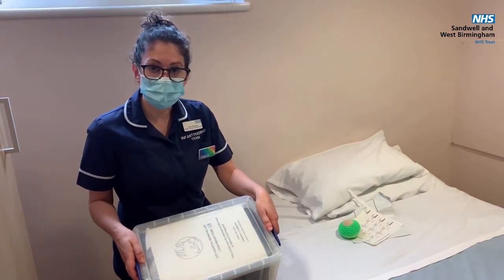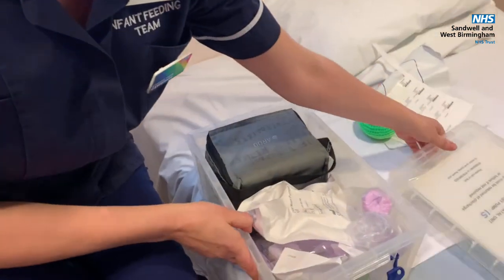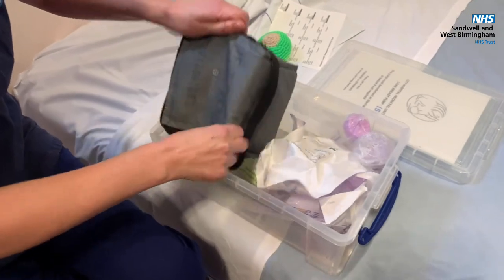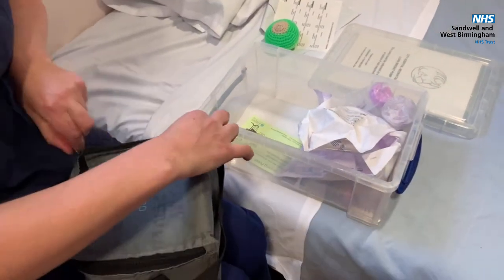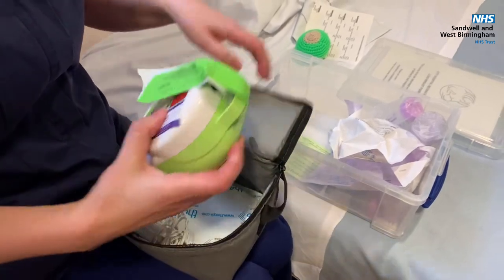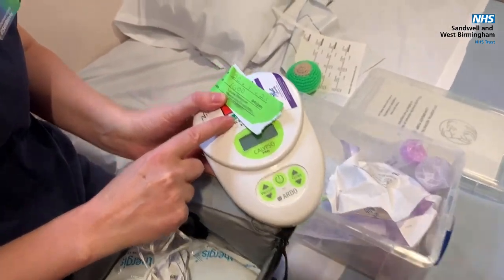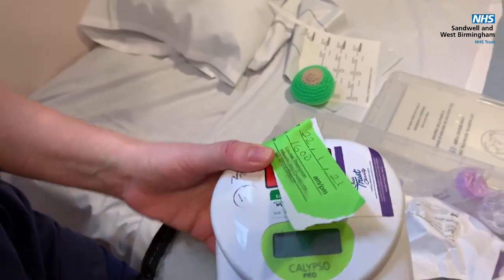The breast pumps come in boxes like this, and in the box there's a cool bag with your little breast pump in it. The breast pump should be labeled to say that it's been cleaned and it's ready to use.